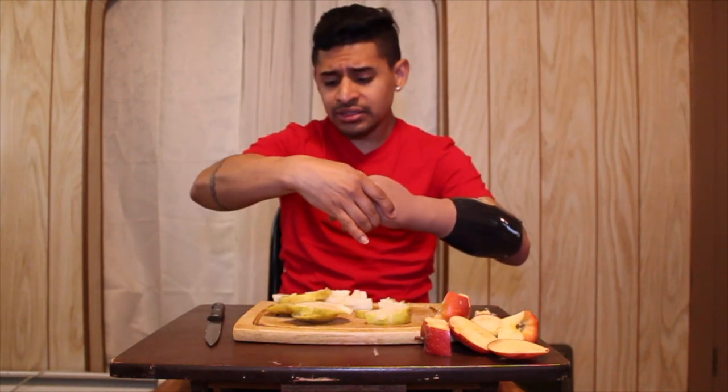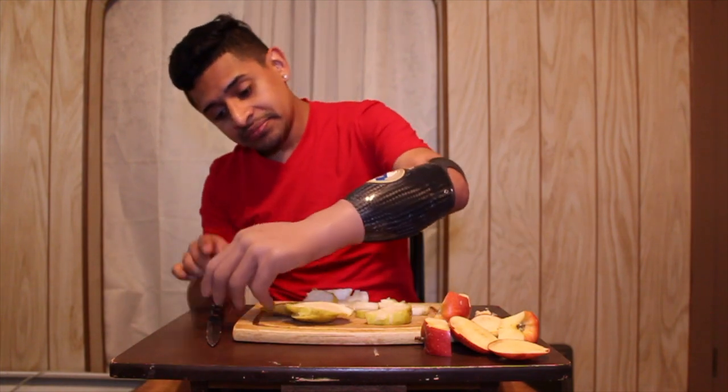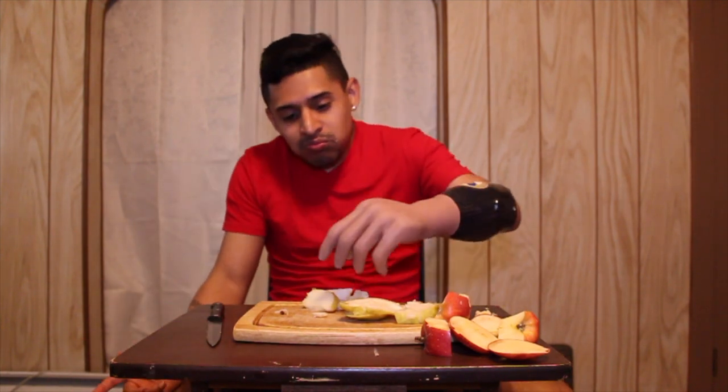Now it's time to eat it. It's kind of hard, I have to grab it. I love pears, it's my favorite fruit. My mom's gonna get mad if I drop it on the floor. I've got to do it with this hand — grab it and eat it. Nice, oh my goodness.